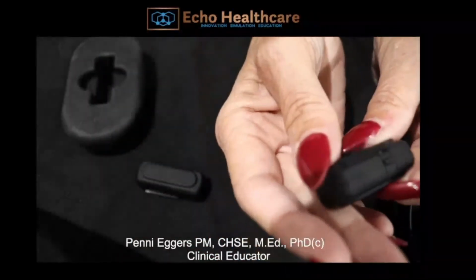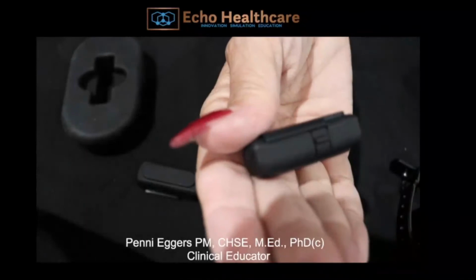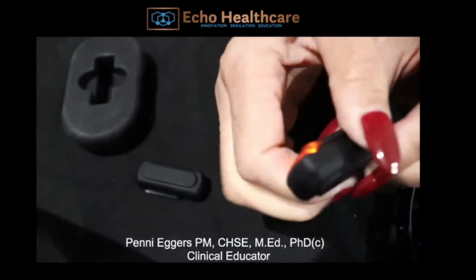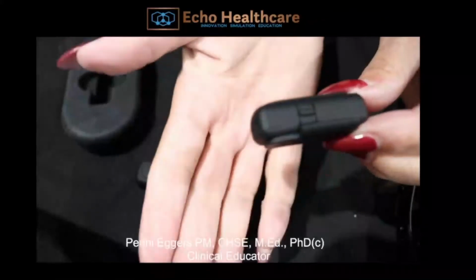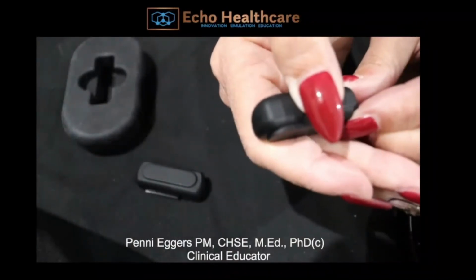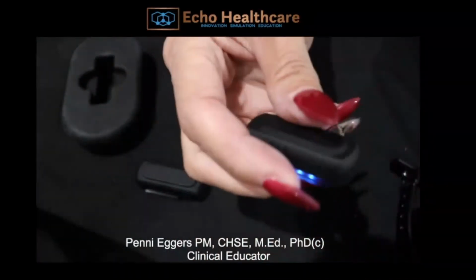Now the module here's where you charge it up. It's got a little USB-C on the back. And on the front is how you turn it on. There's this little tab. You're just going to push and hold that tab. You can hear now it's acting as a metronome. You continue to hold that tab and it lights up. And that means you are now ready to connect.